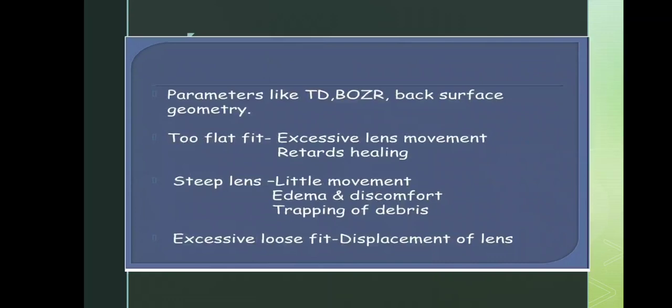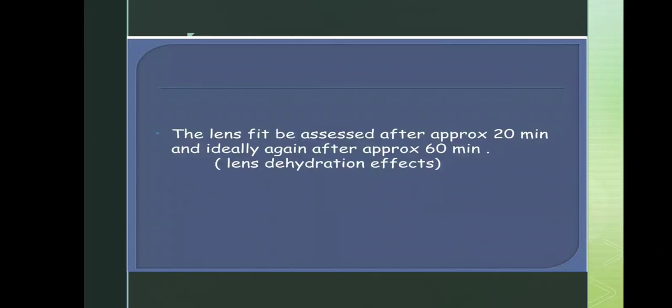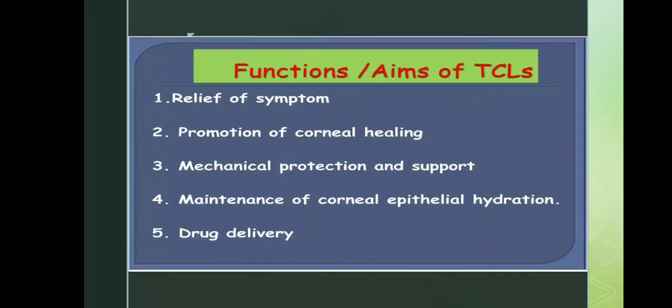If it is too flat a fit, excessive lens movement is provided, which retards the wound healing process. If the lens is steep, it has little movement, causing edema, discomfort, and trapping of debris. If it is excessively loose, it leads to displacement of the contact lens. The lens fit should be assessed after approximately 20 minutes, and ideally it is checked again after approximately 60 minutes.